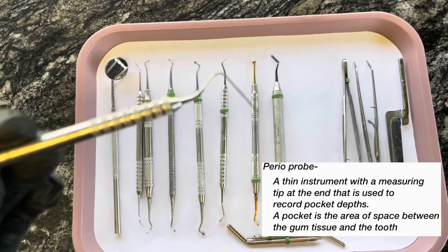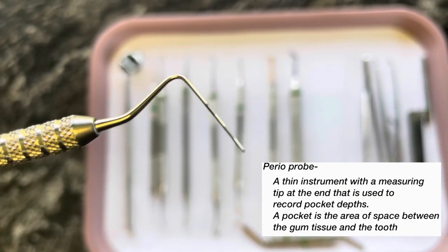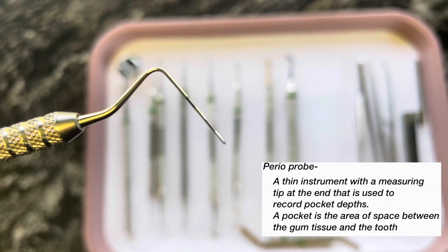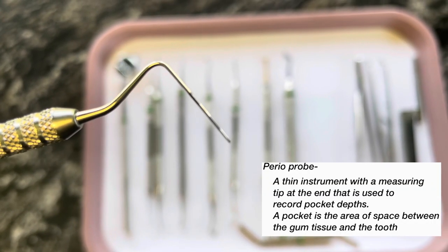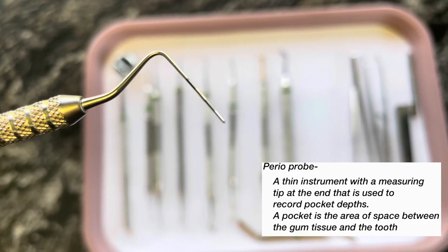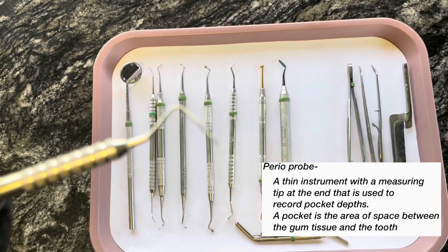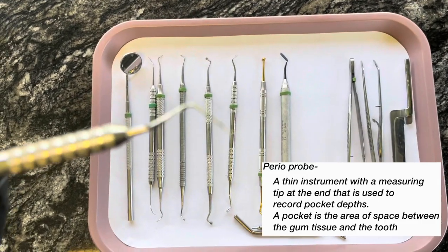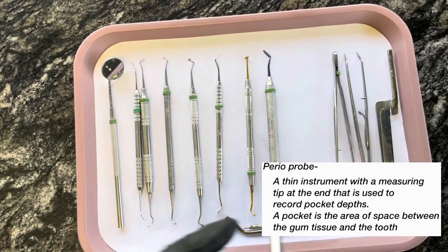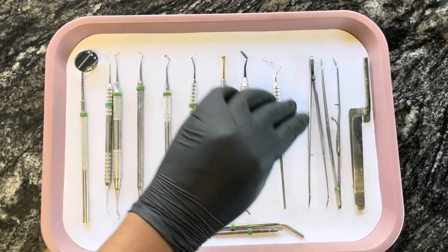Next I have a periodontal probe. A periodontal probe is used to measure the gum tissue — you can see those lines, and those are the millimeters for you to measure. We hardly use these on the doctor's side, but when we do, it's nice to just have them in your instrument pack. Mostly those are used on the hygiene side.